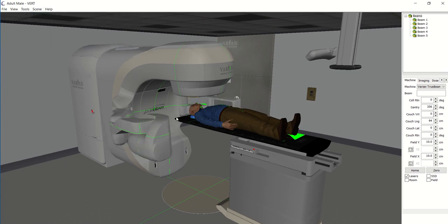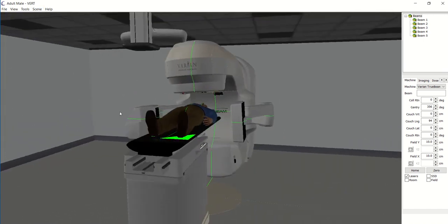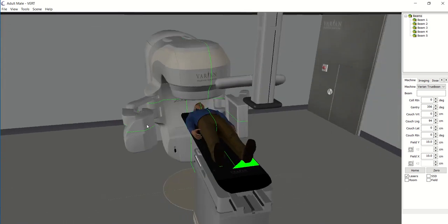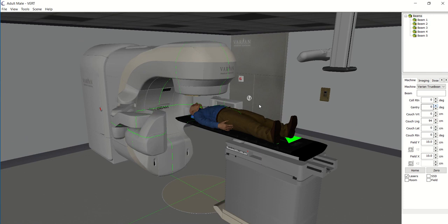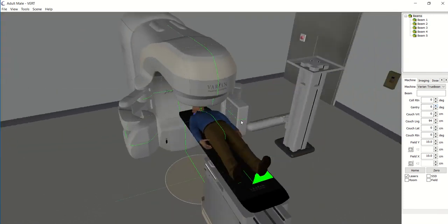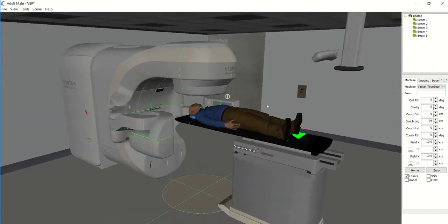Next, we can show you these arms either side of the machine. These actually take x-rays for us, similar to what the diagnostic radiographers do. We use these x-rays to ensure that our patient is in the right position — we take these outside the room, match them to what we have planned for our patient, make sure they're in the right position, and then that's when we start the treatment. Throughout this, we're talking to our patients and trying to build good rapport and communication.